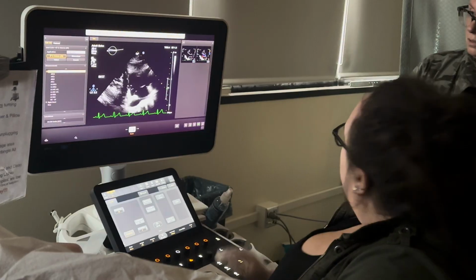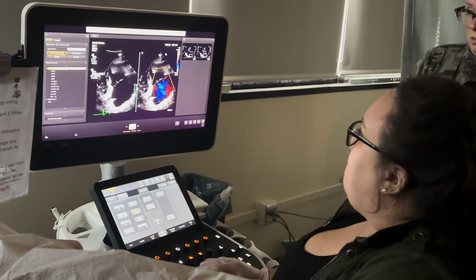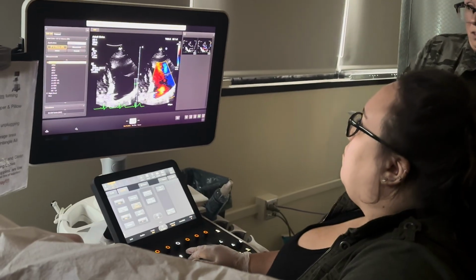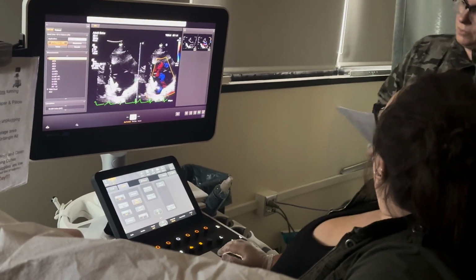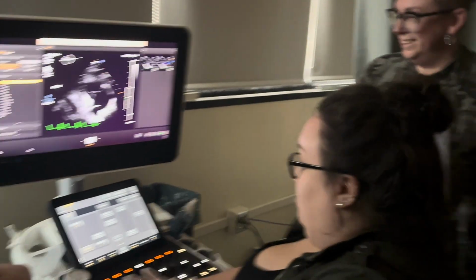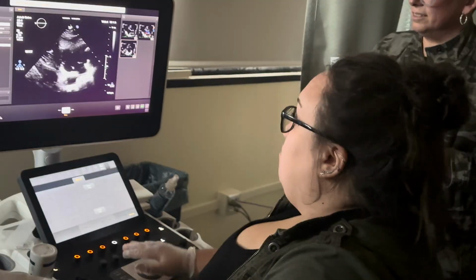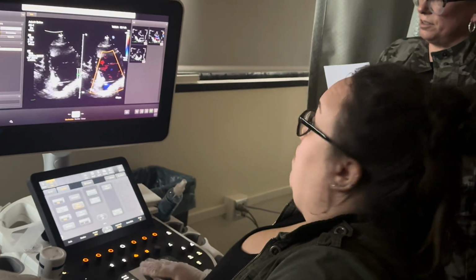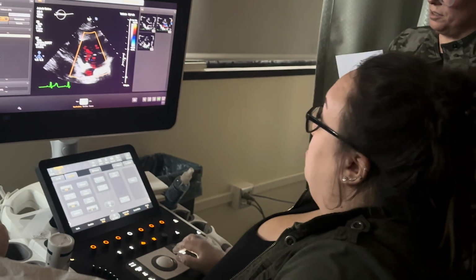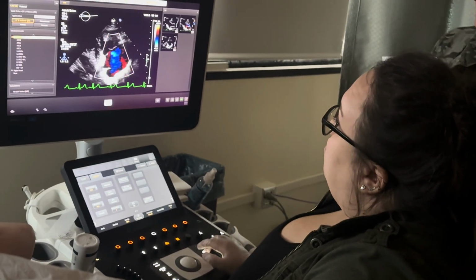Would you prefer color compare? That's up to them. Mainly that's what we do in the field. We don't do that at St. E's. Well, we do it at Mercy. It's completely whatever you prefer, because once you get onto the field, it completely depends on the hospital and the doctors. The doctors are the main problem. Got some TR there.